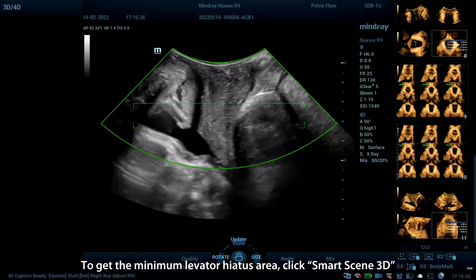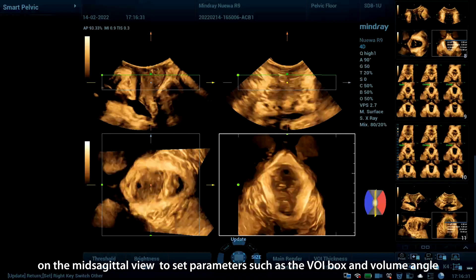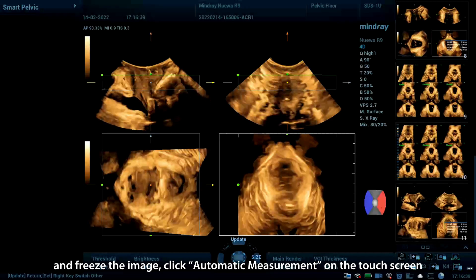To get the minimum levator hiatus area, again click Smart Scene 3D on the mid-sagittal view to set parameters such as the VOI box and volume angle. Guide the patient to do the Valsalva maneuver lasting at least 6 seconds and freeze the image.